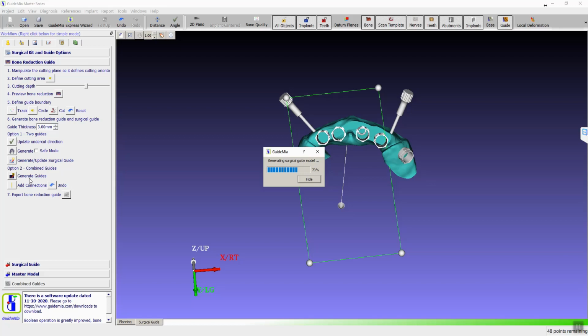This will be a little more interesting of a flap for her. Yes, it's kind of a little complex in terms of how much you need to flap. Well, we watched her last week. She's got no problem flapping. Right. Because we have the tissue level here. So I think the flapping area, you can just go, well, it doesn't really matter. Close to this or a little bit more, a little bit less, so it shouldn't matter.